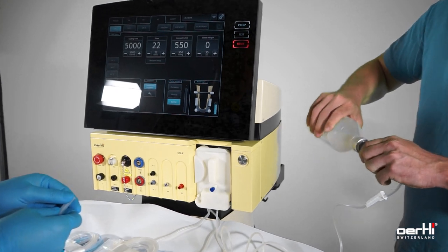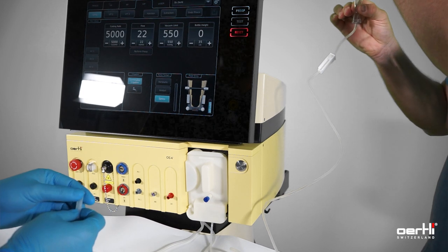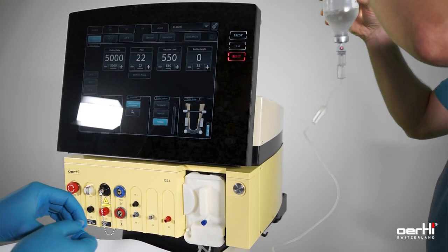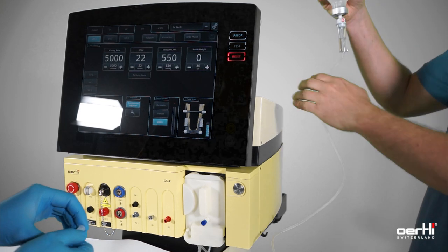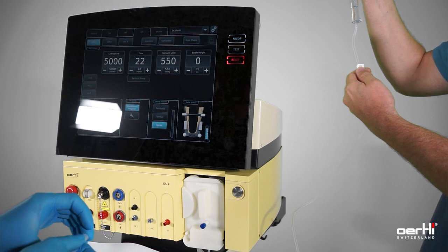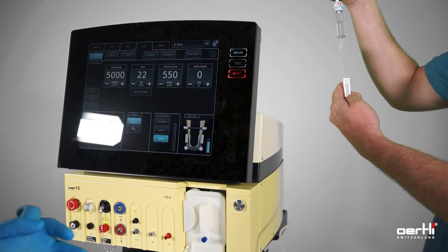Prepare the BSS bottle. The drip chamber should be filled approximately 50 percent. If it is too full, you may lose stability; if it is too low, you may also see instabilities. Ensure that the valve is open.